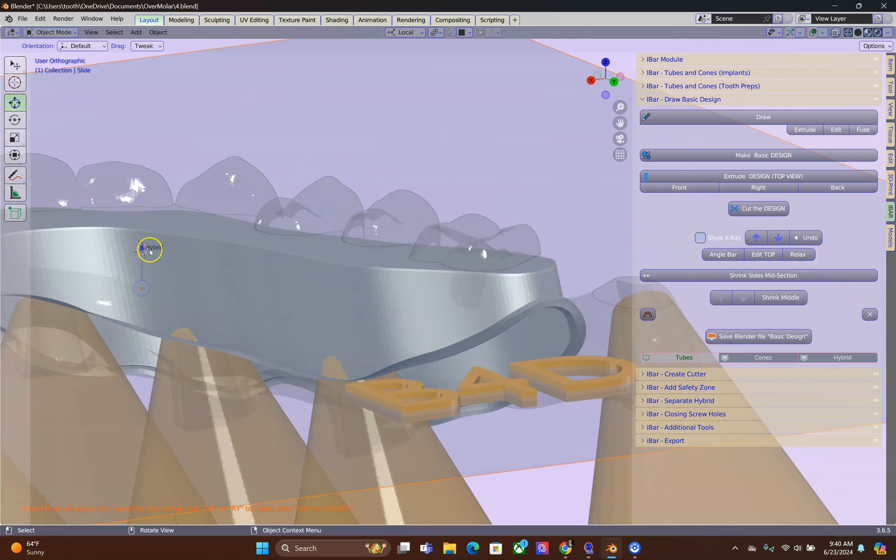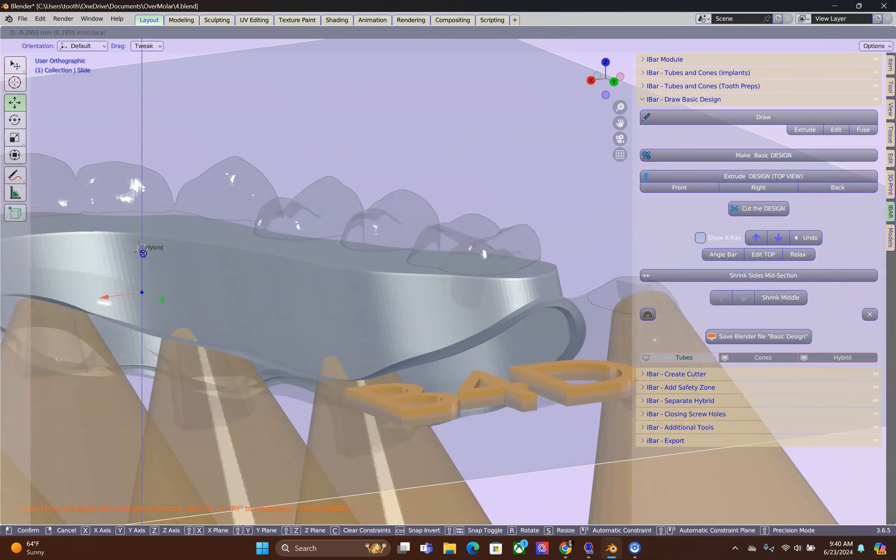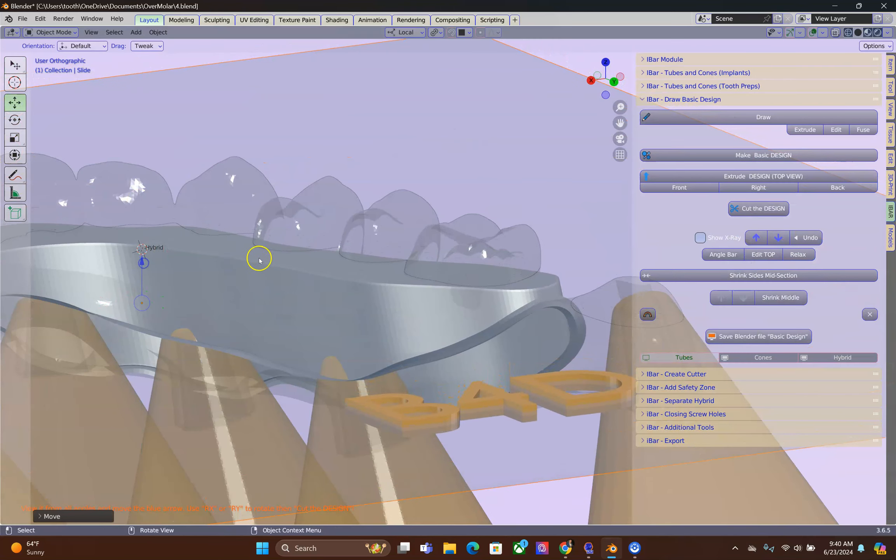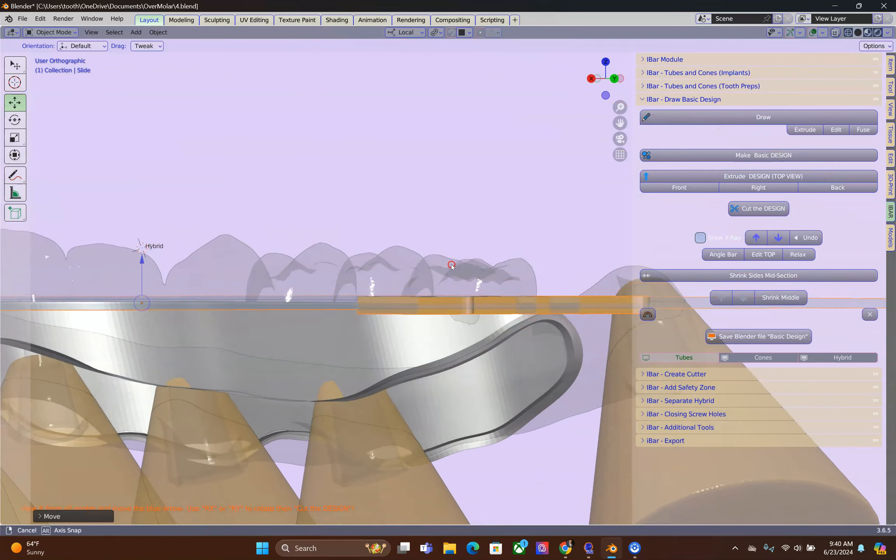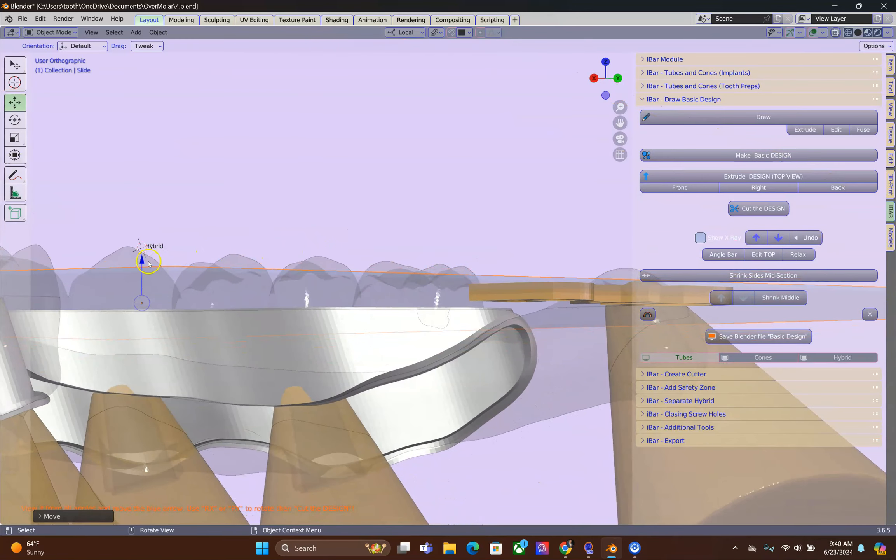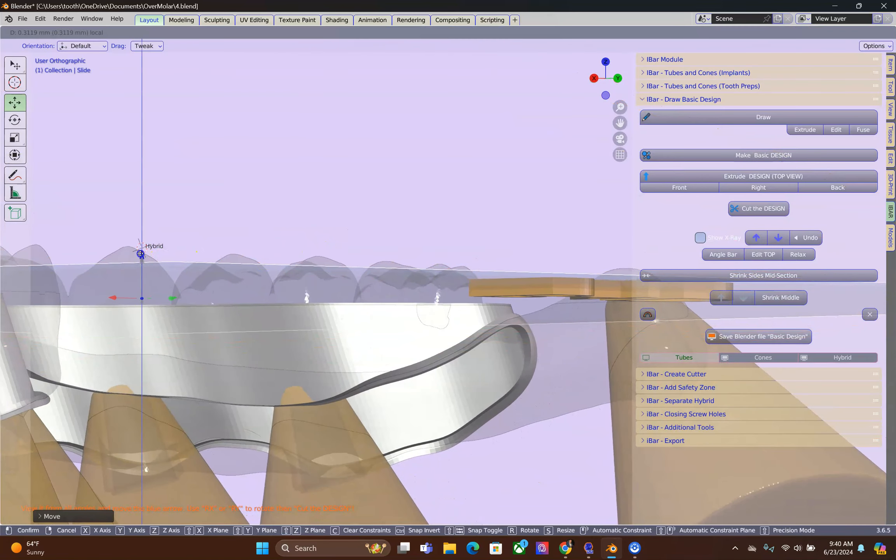I'm going to lower it just a little bit, not too much. And then we're going to cut it.